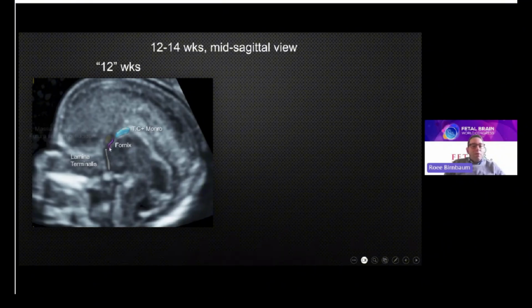So this is the area of the fornices, and anterior to the area of the fornices, we see the thicker cellular area, which is very nicely seen here. It has a different echogenicity from the falx, and this is the massa commissuralis, and this is where the septum pellucidum will eventually develop. Again, there is no cavum at this stage.